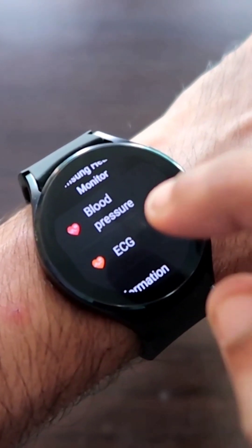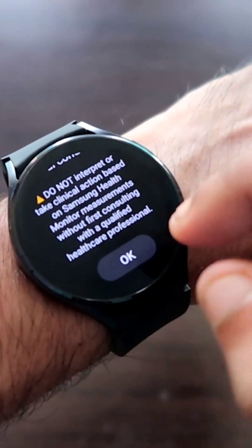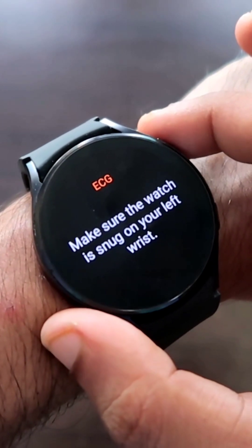Via this watch, I will click on that and now I will get the instructions on how to measure the ECG. I have to click OK, and here I will have to rest my finger lightly on the home key.